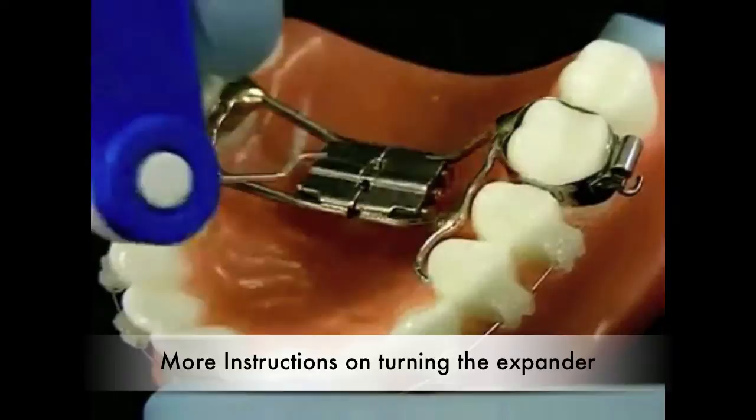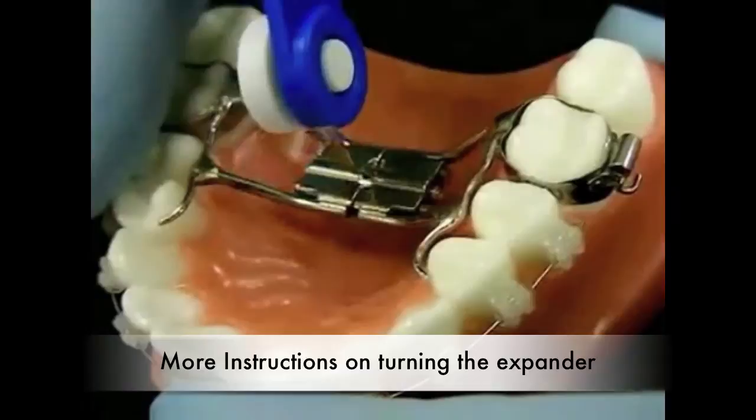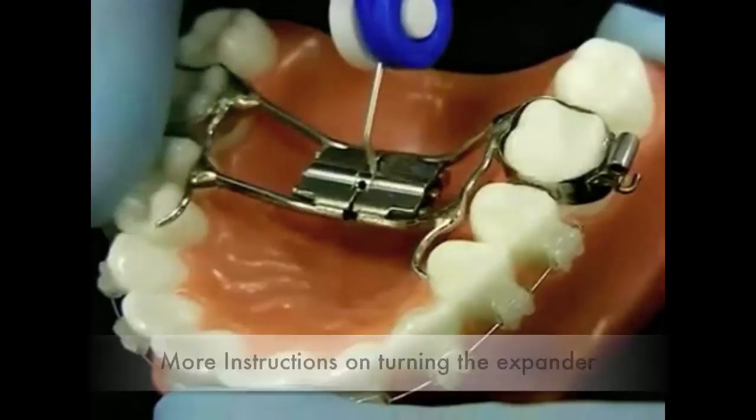To turn the screw, insert the key into the hole of the screw. Next, turn the screw by pushing towards the back of the mouth until you see the next hole in the screw. Then remove the key from the screw without turning the screw backwards.